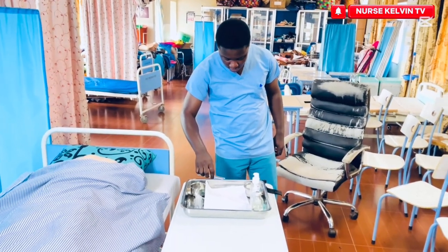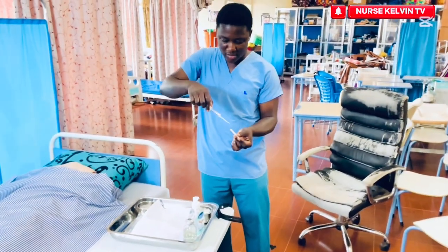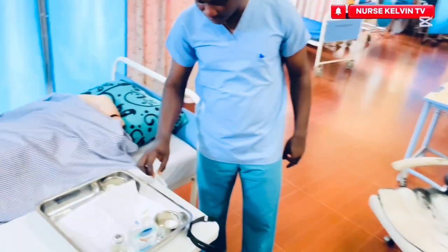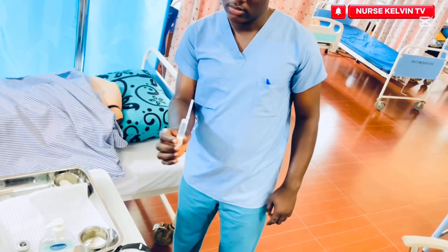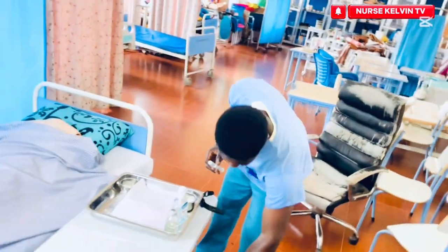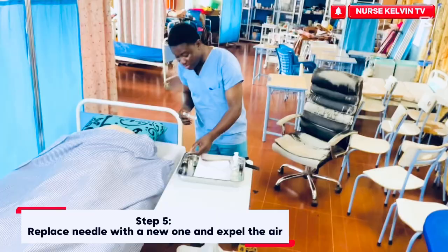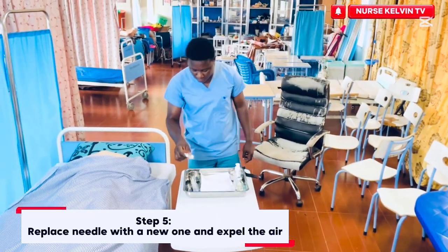Make sure that most of you hold the thing like this. If you see it normally at home, it's wrong. The thing will be here like this. Then you throw this away in the safety box. Then you insert a new one. So this is the new one, and this is the medication.